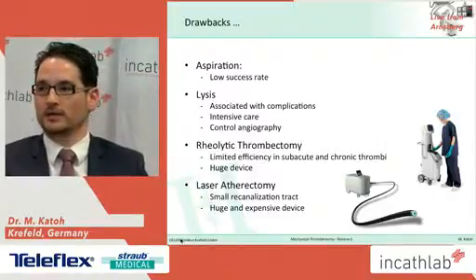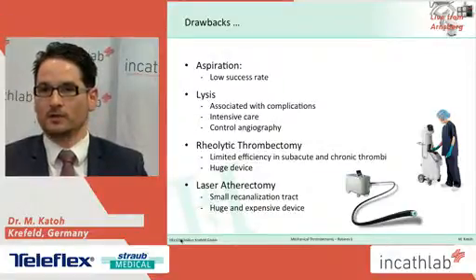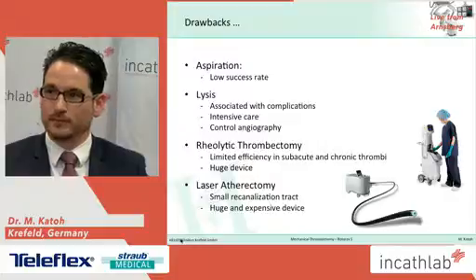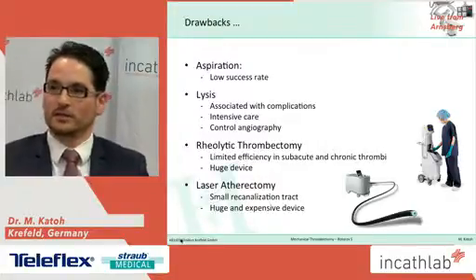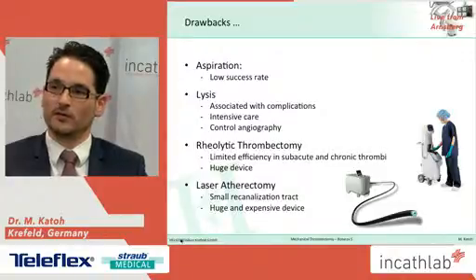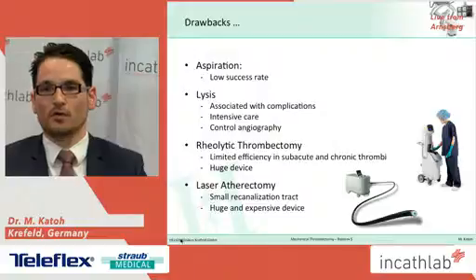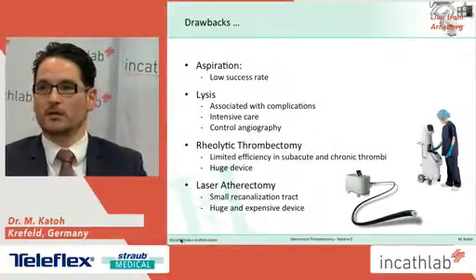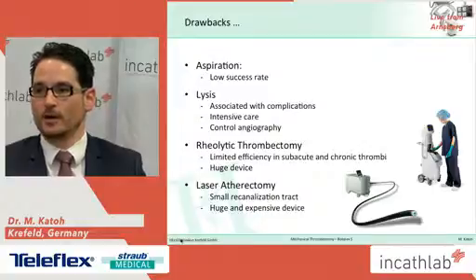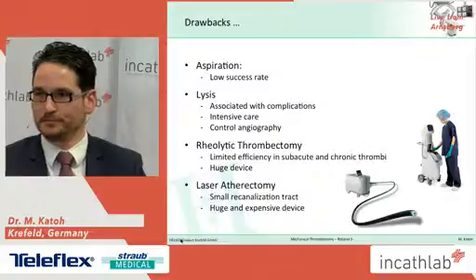Rheolytic thrombectomy devices are also limited in efficacy in older thrombotic material. Laser atherectomy is also limited since it only allows establishing a relatively small recanalization tract, and both devices come with a quite huge power unit and are quite expensive.